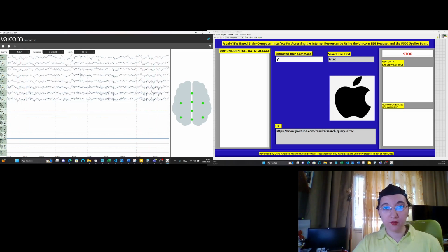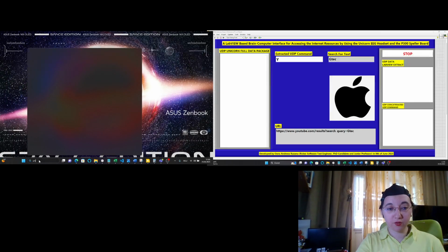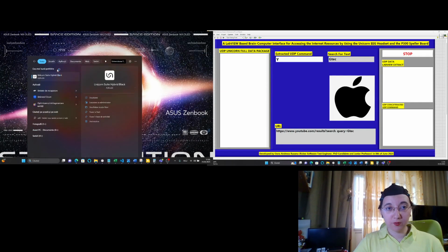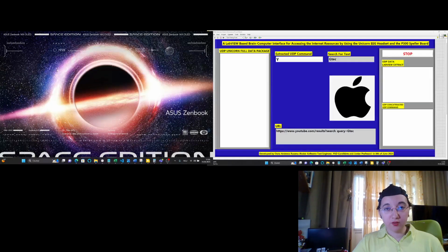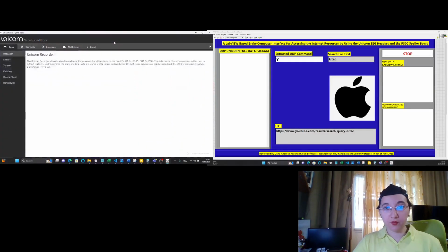So now it's time to continue with the next application, the P300 Unicorn Speller Board. I close this one and I will open again the Unicorn Suite Hybrid Black. This EEG headset is released by the g.tec Medical Engineering company from Austria, and it provides both free and paid software.